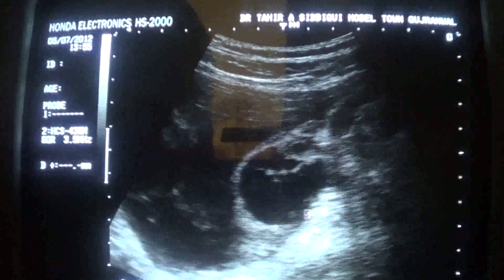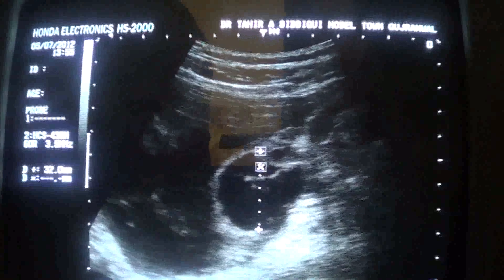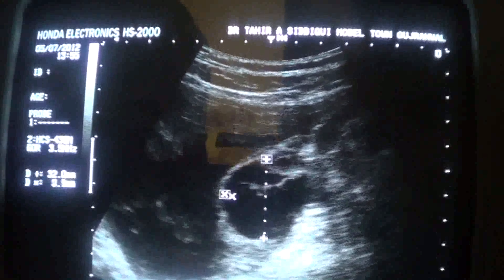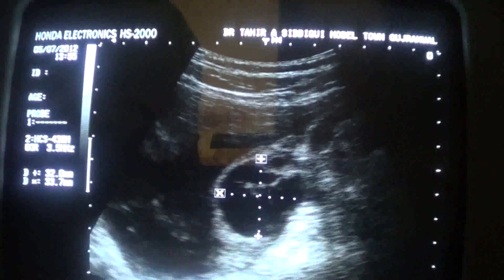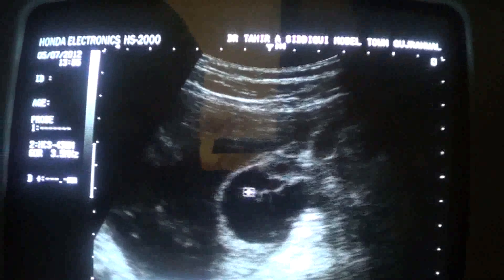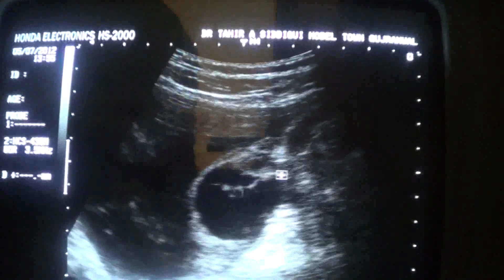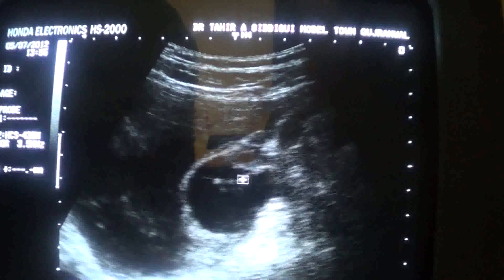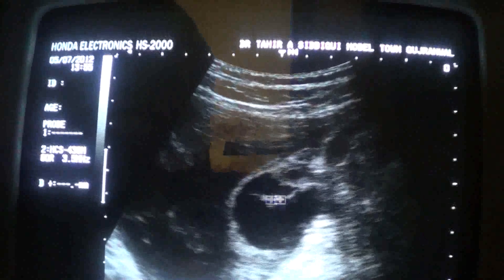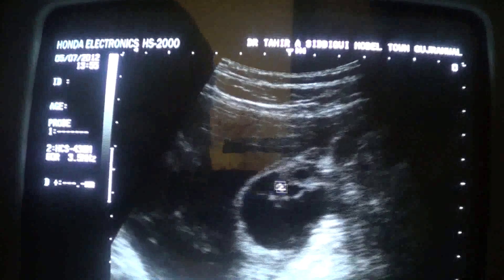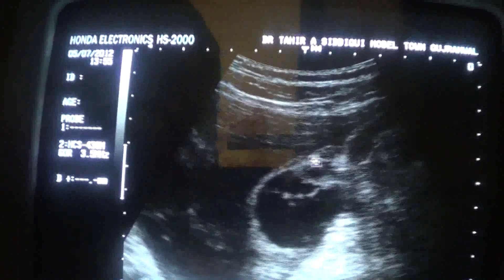This is the retention ovarian cyst measuring approximately 3.2 by 3.3 centimeters. You can see there are a few septae — this is a thick septa and a complete septal, this is a thin septa, incomplete septa — so there are a few septae within it in the interior segment. However, otherwise there is no calcification and no solid element seen within the cyst.